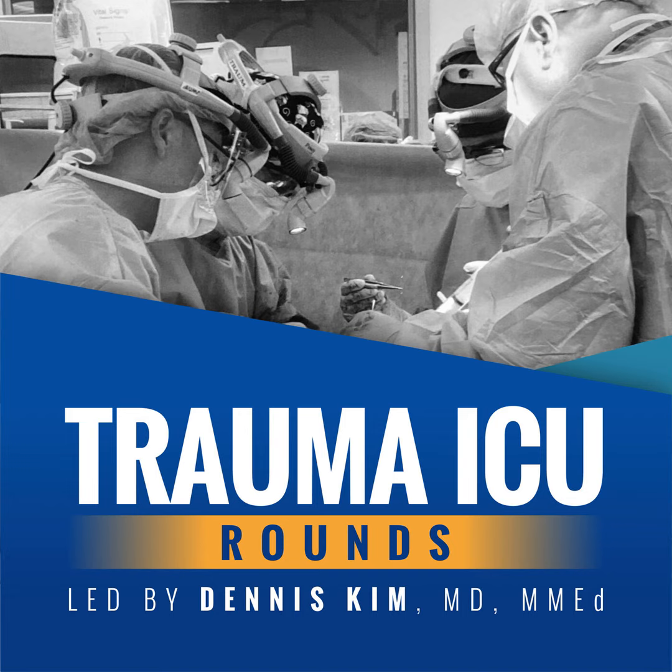Regarding objective number 1, the type of breath. When it comes to the type of breath delivery, there are really 3 types of breath. Number 1, we have mandatory breaths. Number 2, spontaneous. And number 3, assisted. Mandatory, aka controlled breaths, are breaths for which the ventilator controls the timing, tidal volume, or both.